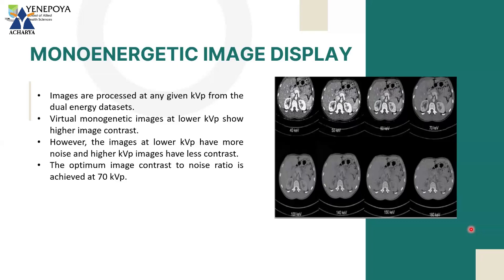But I won't say it is a limitation. If you want to see the differentiation in particular things, spectral imaging will help you with a lot of data, right?